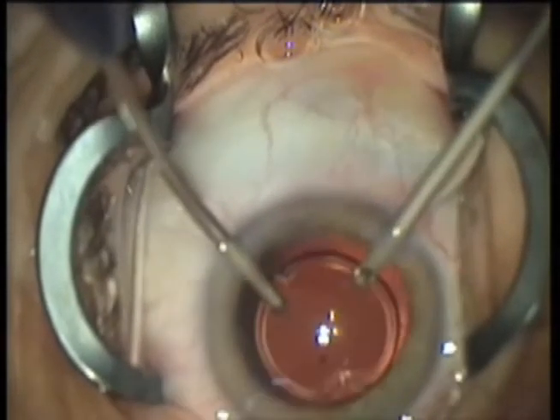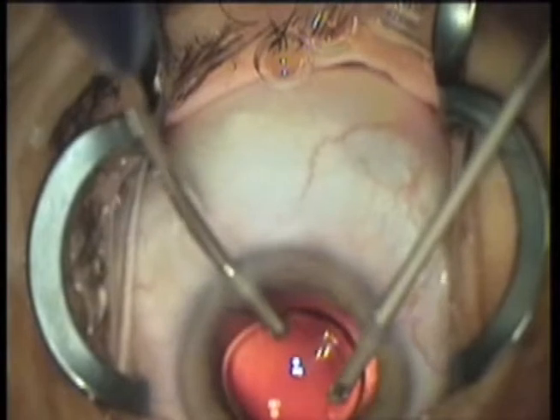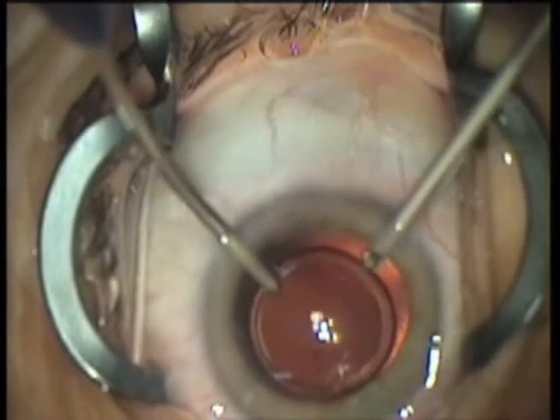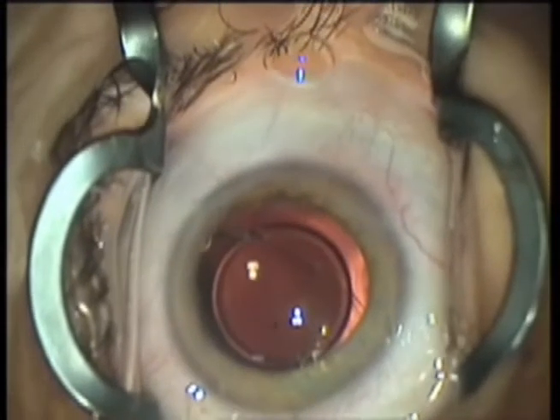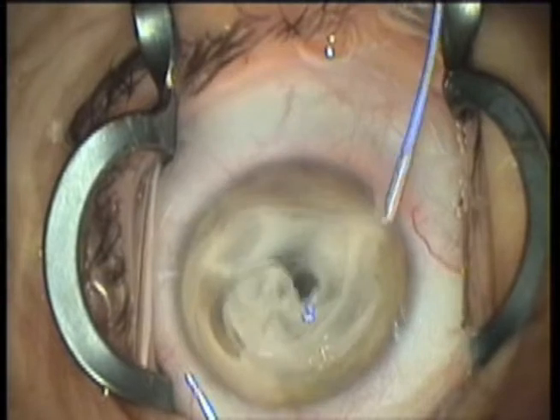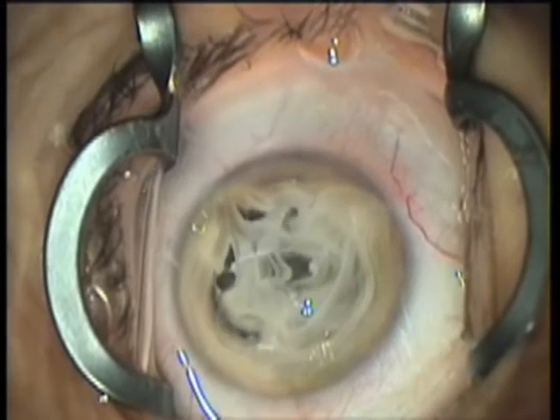To remove the OVD, use once again the bimanual paracentesis approach with the irrigation cannula and the vitrectome. The last step is to inject triamcinolone once again to confirm that all vitreous meshwork has been cleared from the anterior chamber.